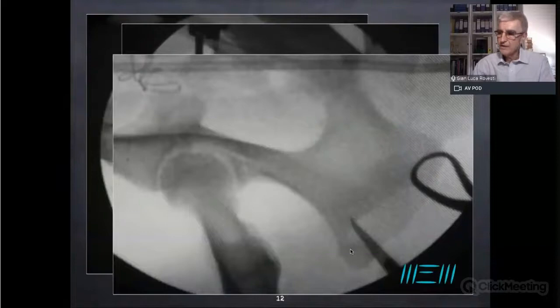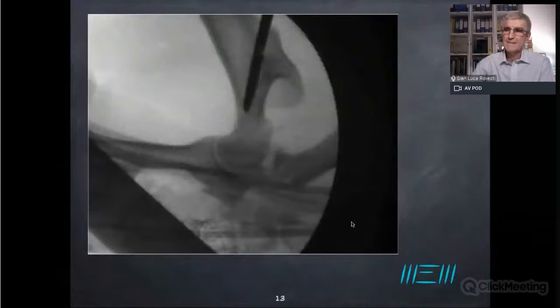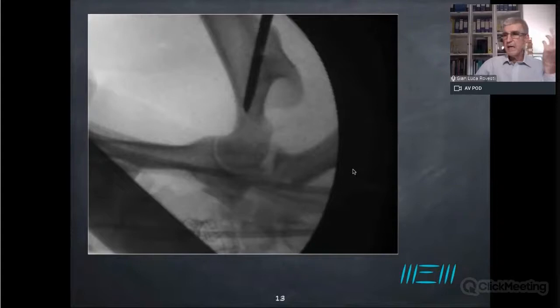What happens if I need to perform a reduction of an acetabular fracture, for example? I don't want to get into this area because I don't think I will be able to get a good reduction, but I want to realign, okay? If the dog is a very small one, we can also use rectal palpation and push through the rectum. This is usually not possible with bigger dogs because we don't have 20 centimeter long fingers. So my preferred technique, in order to realign the fracture, not to touch the fracture, not to anatomically reduce the fracture, but to realign it, is this joystick technique.